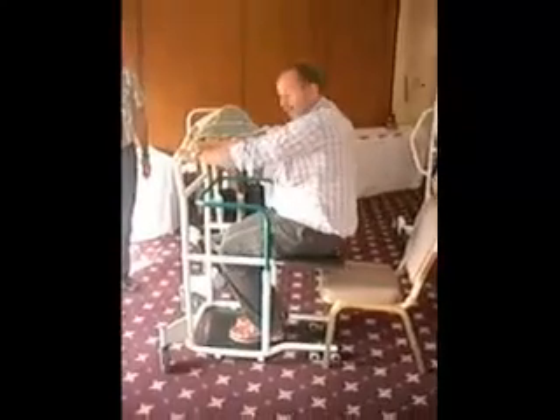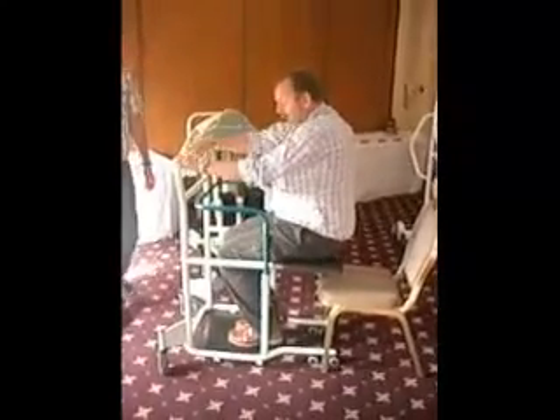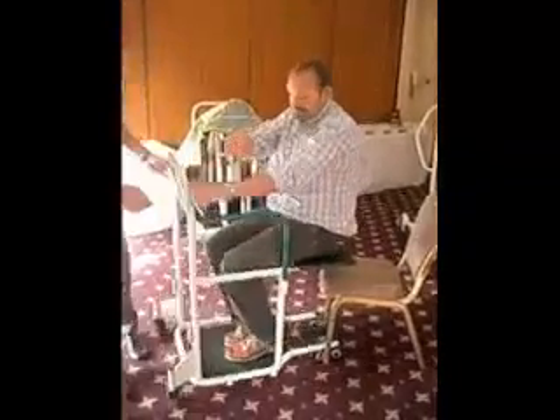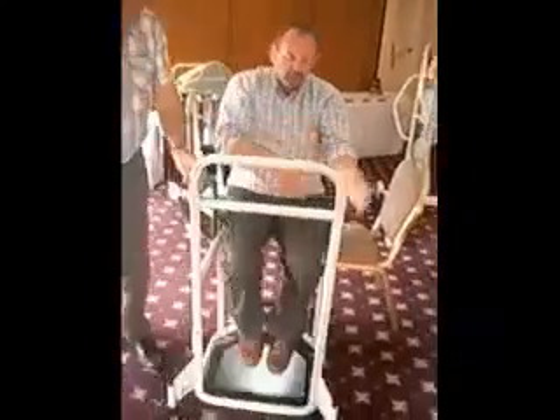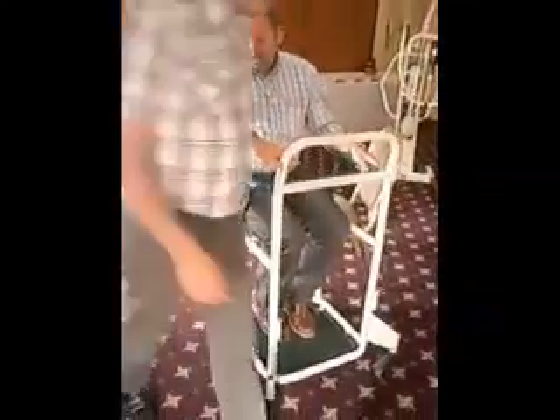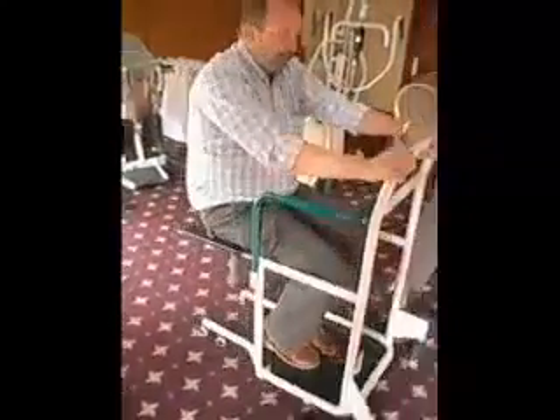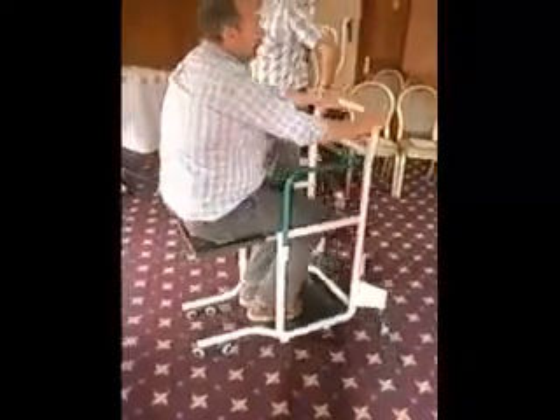And how easy is it to push around? It is very easy to push around — just go around me. To that side you just go around, or you walk here or you walk there. Don't start pushing around my body, just go around my body.